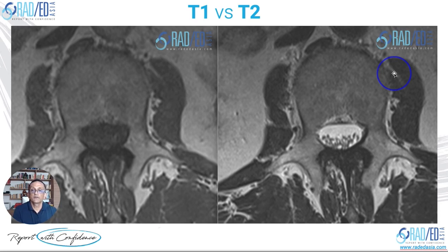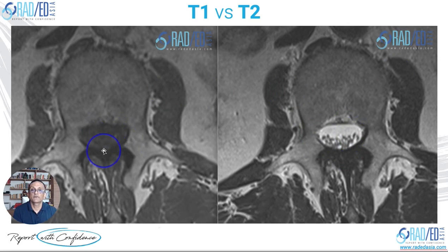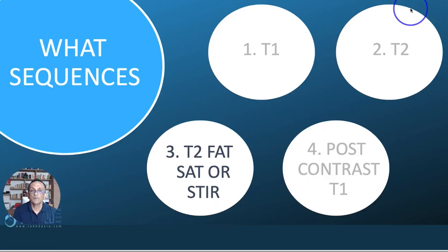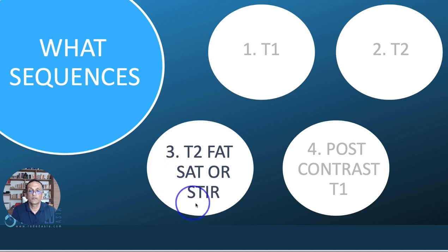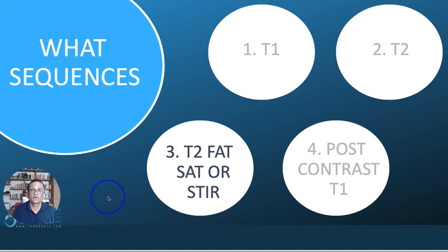Looking at these two side by side: T1 has dark CSF, T2 has bright CSF. Fat is bright on both of them. The third type of sequence you need to know about is a T2 fat saturation, or a different type of scan which produces the same result called a STIR sequence.